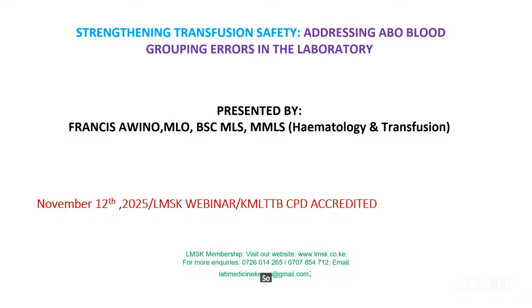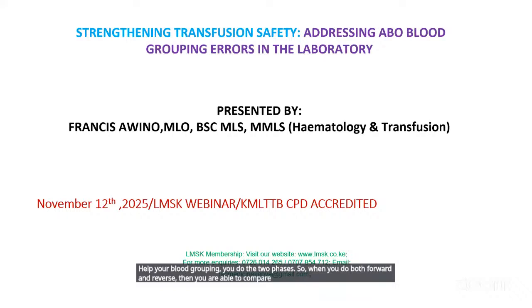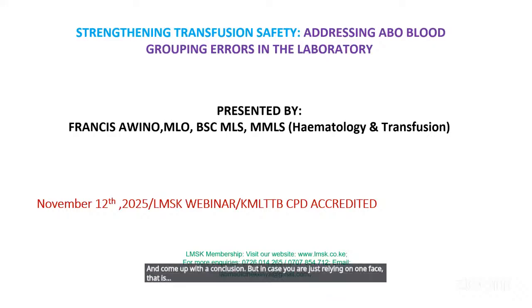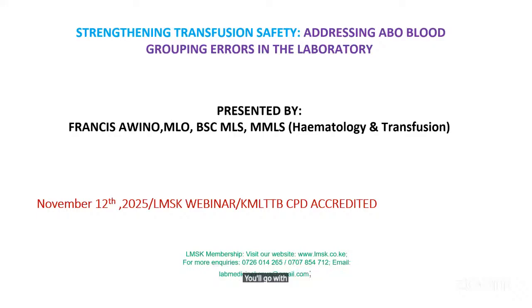So it is encouraged that when you are doing ABO blood grouping, you do the two phases. So when you do both forward and reverse, then you are able to compare. And if there's a discrepancy, you'll be able to resolve that particular discrepancy and come up with a conclusion. But in case you are just relying on one phase, that is, you are just typing, let's say, the forward typing alone, you'll go with that and you'll miss out on the reverse.